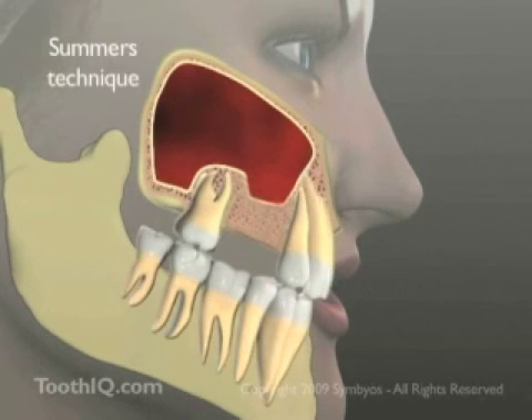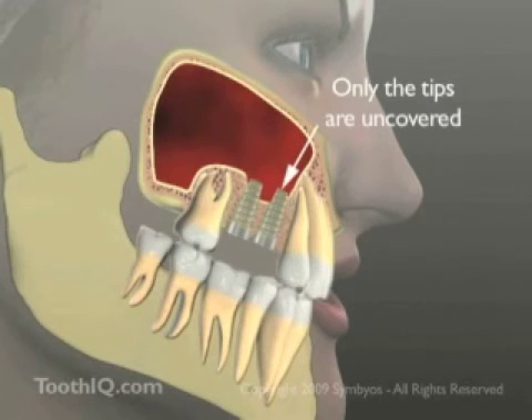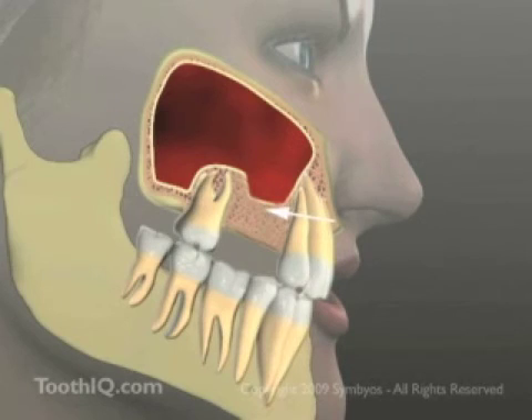The Summers' technique for grafting the sinus floor is commonly performed when less bone volume needs to be regained. Here, just the tips of the dental implants would be uncovered, and more bone is present in the sinus floor to stabilize the implants.